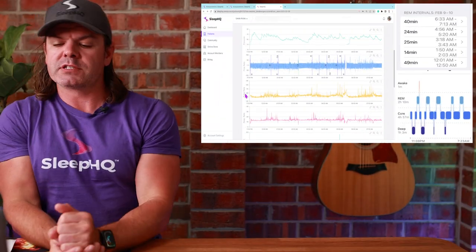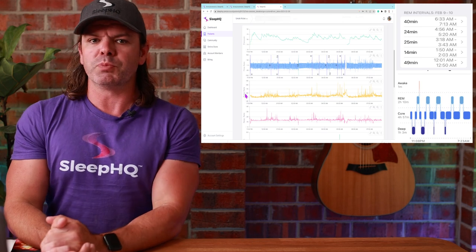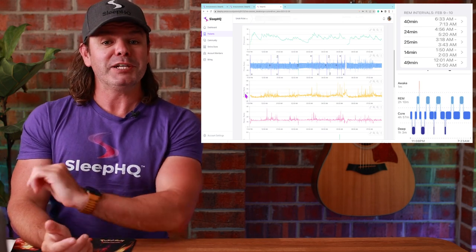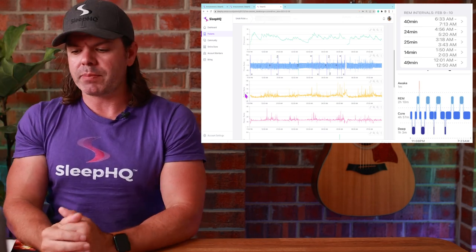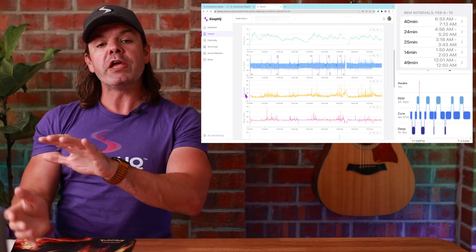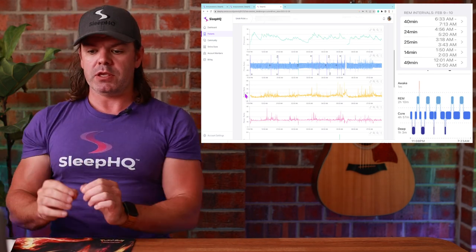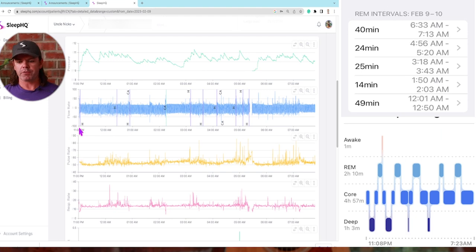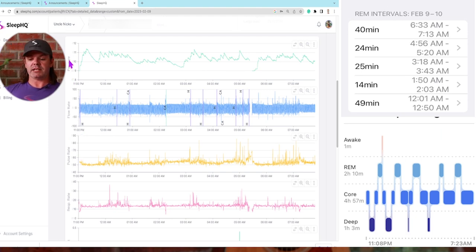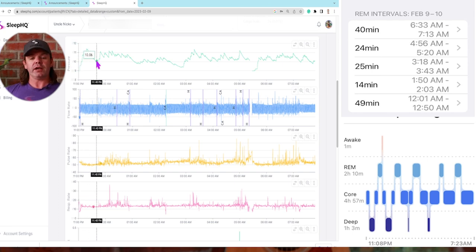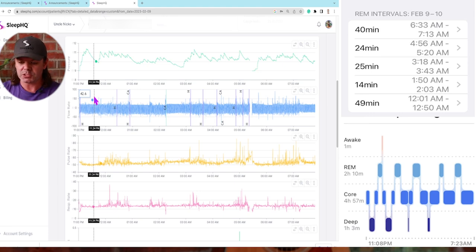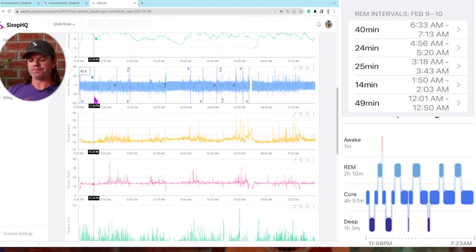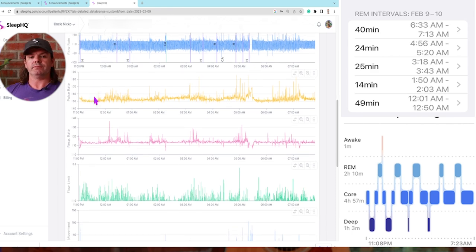So here we are over on the Sleep HQ dashboard. And what a dashboard it is. If you'd like to get your own dashboard, click the link above, grab yourself a free account. Now I've reordered the charts, which is something you can do with Sleep HQ and I'll run you through them. To start, we have the pressure delivery from his AirSense 10 machine, automatically going up throughout the night. We've got the flow rate, which is Phil's breathing every breath he takes. We can see in high detail, high definition.